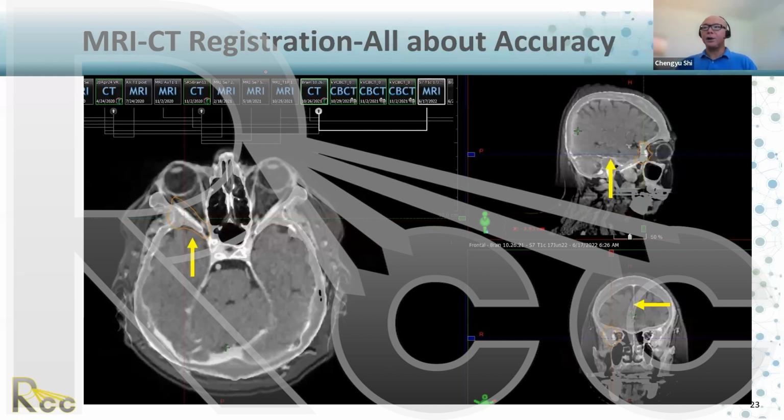So what you suggest is I do a local setup, then go further ahead. My suggestion is use the treatment planning rotation, pitch, roll, to 6D readjust the MRI with CT.